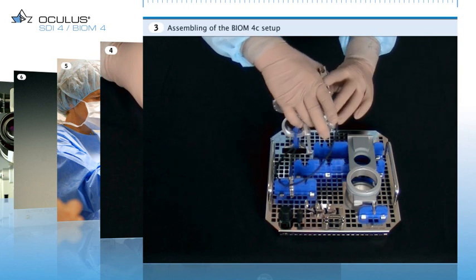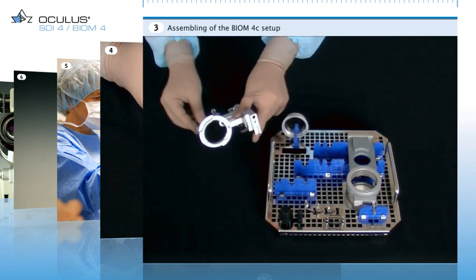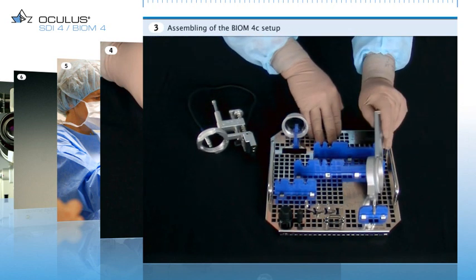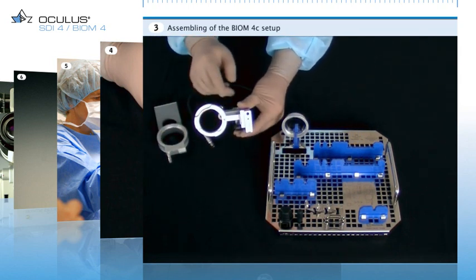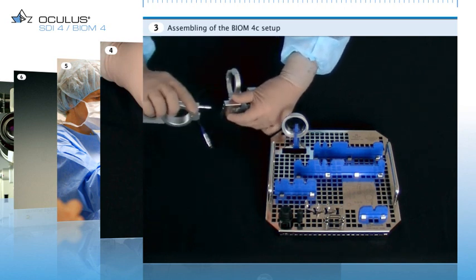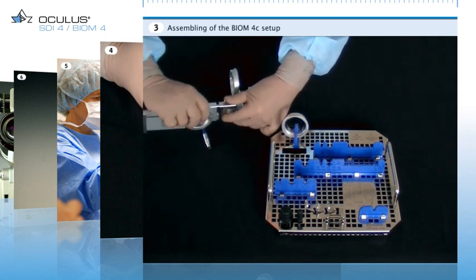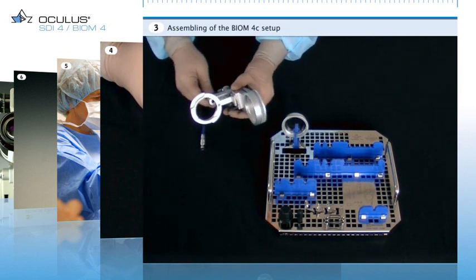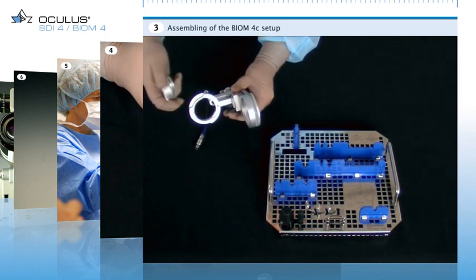The components are assembled on a sterile drape. Here you see the Biome 4C with its corresponding adapter. For assembly, take the Biome and mount the adapter onto the corresponding plug part of the Biome. Then attach the reduction lens to the Biome with a quick-release fastener.